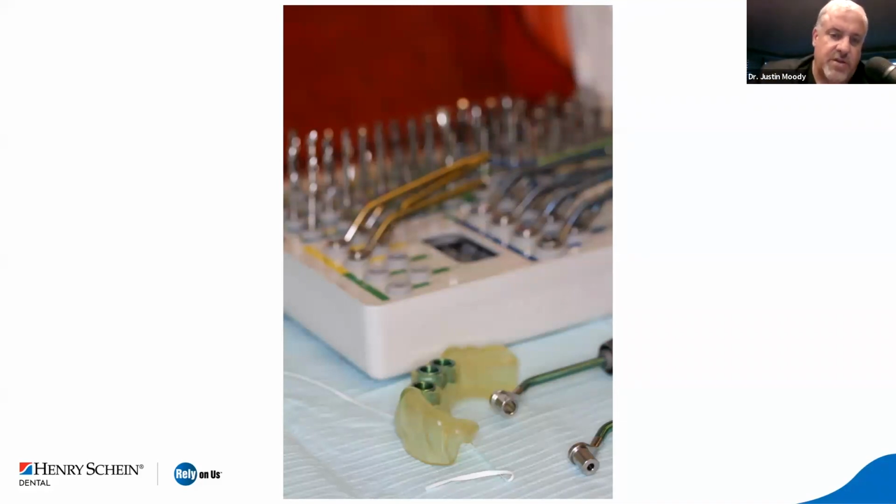Here, in conjunction with the BioHorizons guided surgery kit, we have our sleeves. The sleeves are color coordinated to the BioHorizons implants, and allow us to stay in authentic OEM parts.